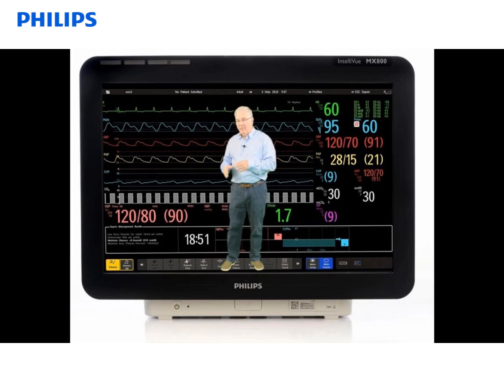Down below we have the power button. The power button will be green when the power is turned on and the monitor is functioning, and it may be red if there's a problem with the monitor. If that LED is red, you should contact your biomedical engineering department for assistance.